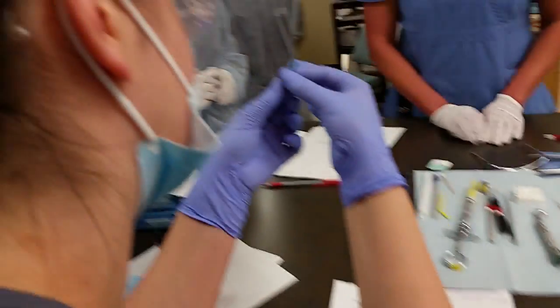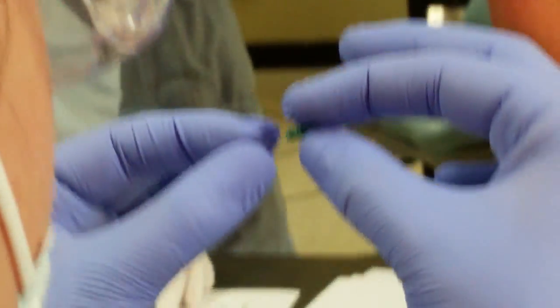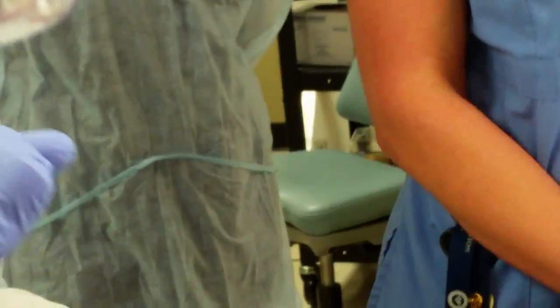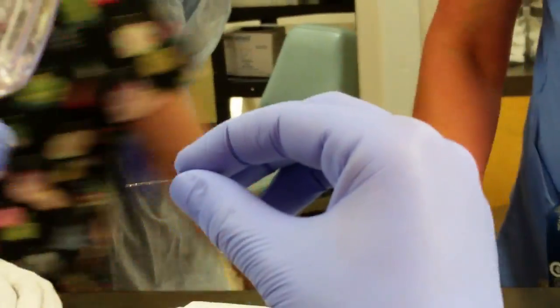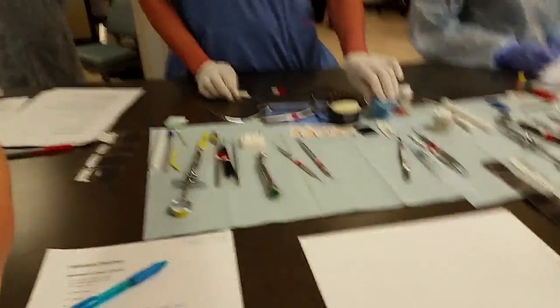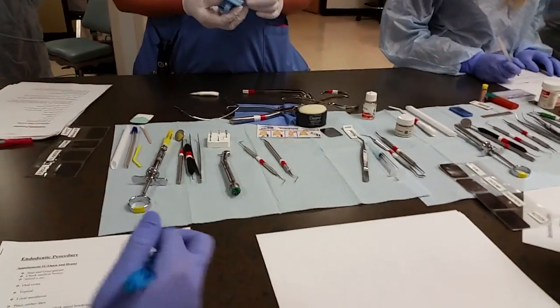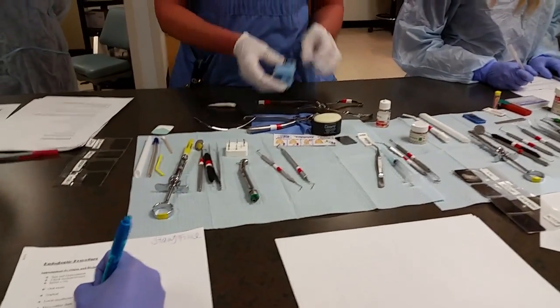Does it kind of grab the nerve and twist it around to pull it out? Yes, that's exactly what it does. They come in different sizes depending on how large the tooth is. Then we have our various files.